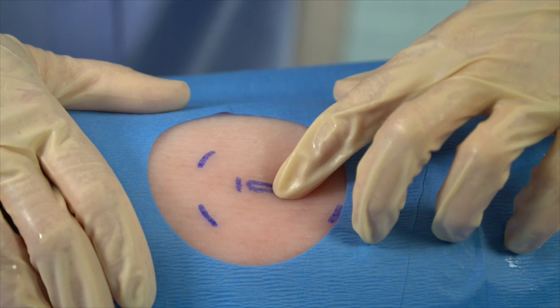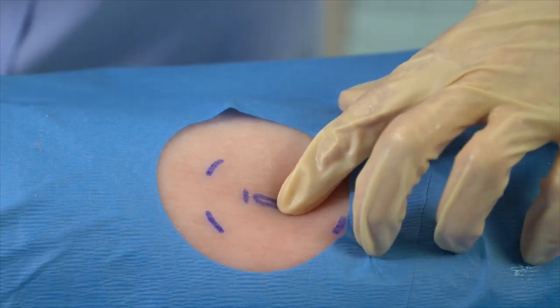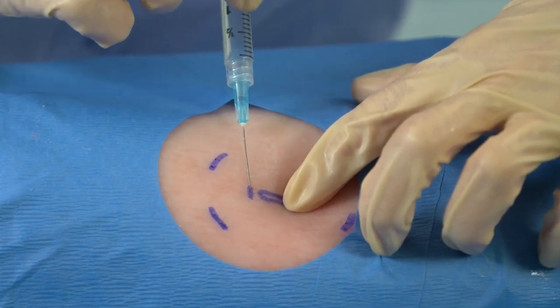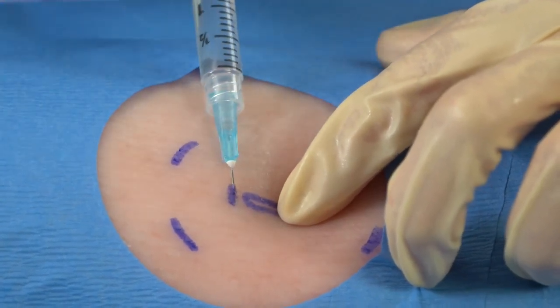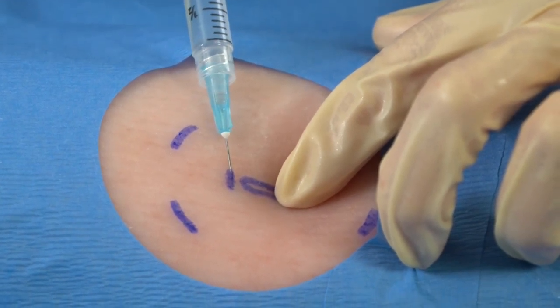It's important to maintain constant contact with the sensor's proximal end until the sensor is removed. With your dominant hand, pick up the syringe containing lidocaine from the sterile field. Insert the syringe needle at the planned incision line at a 20-degree angle, aspirating for blood return. Remember, if blood appears in the syringe, you'll need to remove and redirect the needle, repeating the aspiration step.